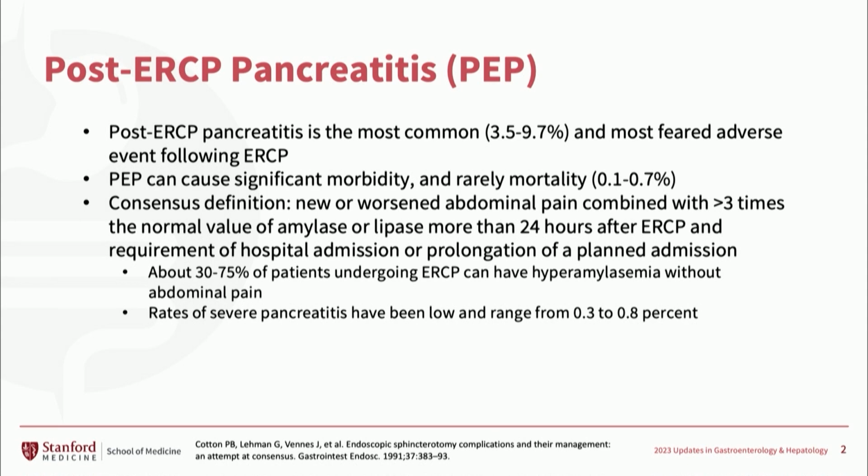Before we move forward, it's probably worthwhile reviewing the definition of post-ERCP pancreatitis. Asymptomatic elevations in pancreatic enzymes are quite common following ERCP, but post-ERCP pancreatitis, or PEP, is really defined by the combination of that with symptoms, namely abdominal pain. And based on this consensus definition by Cotton et al. 1991, the requirement of hospital admission or prolongation of an existing admission.